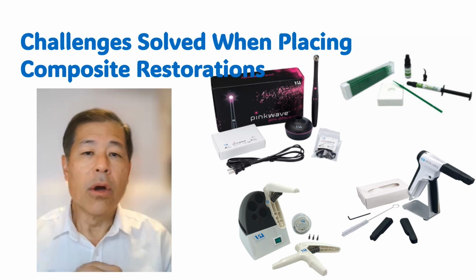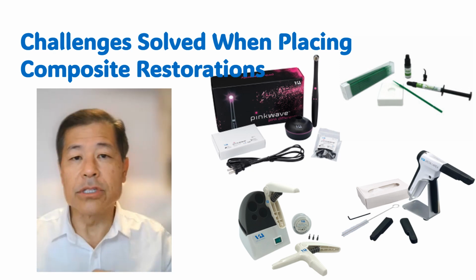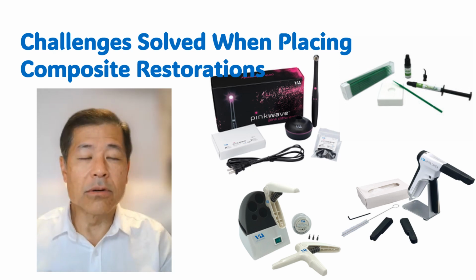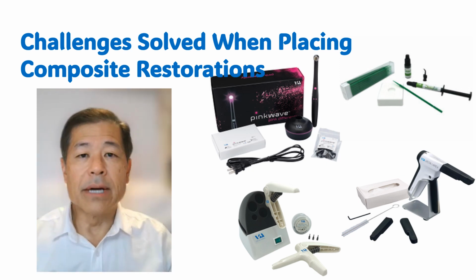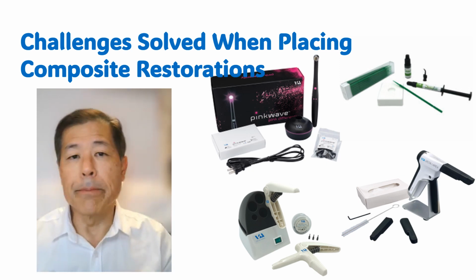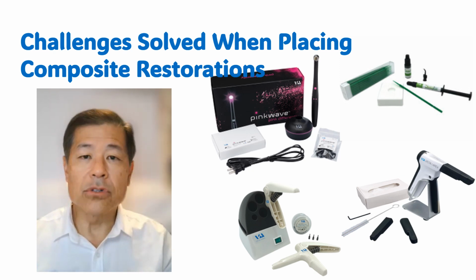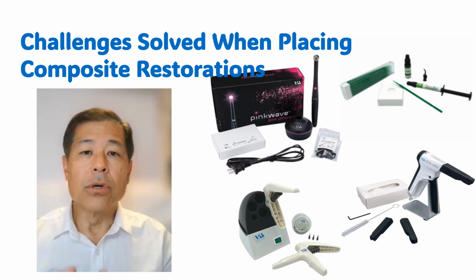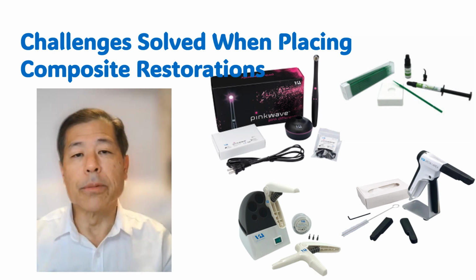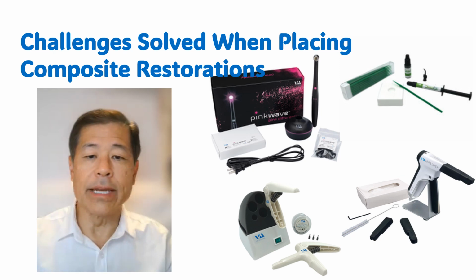It's like spreading warm butter over a piece of bread where it just goes into all the little nooks and crannies versus a cold slab of butter on a piece of toast where all the crumbs fly all over. So you want to warm your composite, and research has shown that you get better adaptation to your cavity preparation. It improves the physical properties of the composite, and you get better depth of cure. So there's so many positives to warming our composite. It's just many of us haven't been exposed to that. So that's what I'm hoping to do right now.